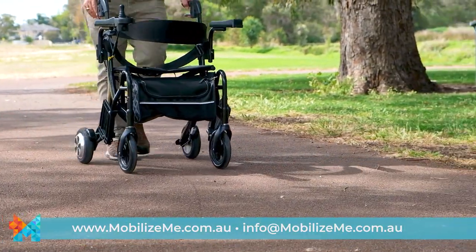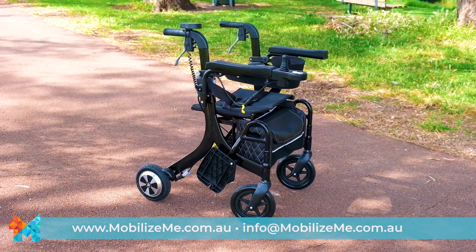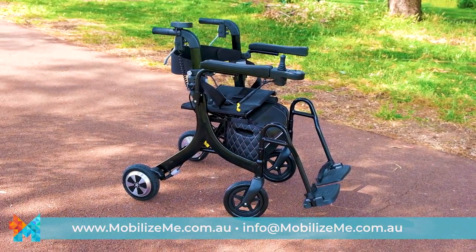Introducing the eTraveler Evo, an electric rollator or push-assist wheelchair that transforms into an ultra-lightweight electric wheelchair in seconds.